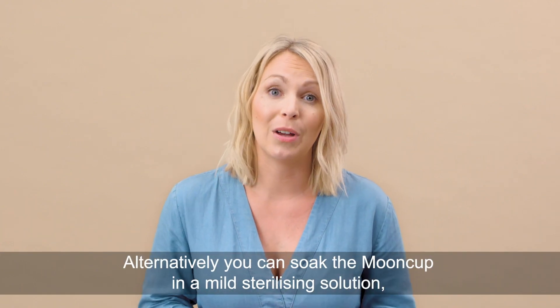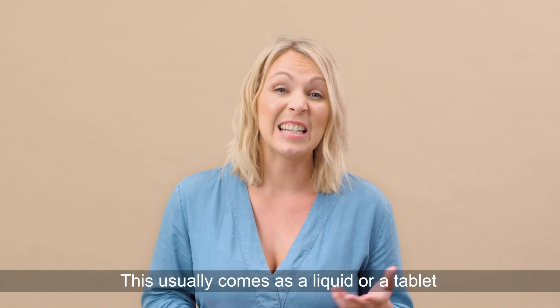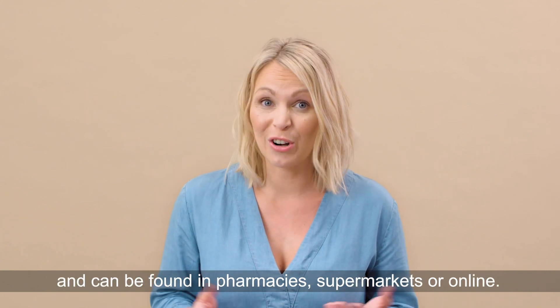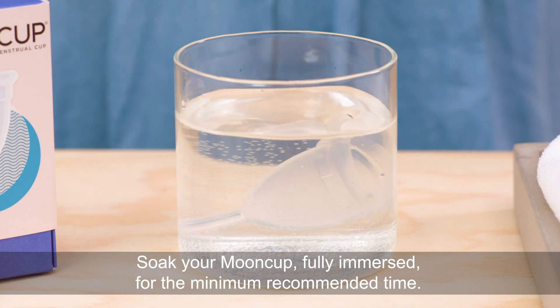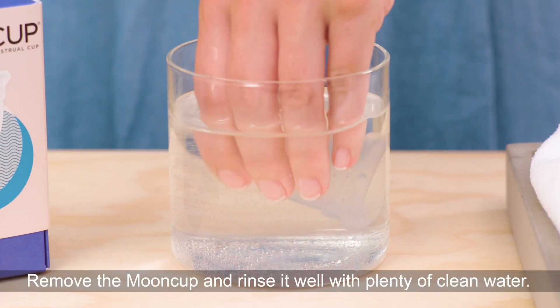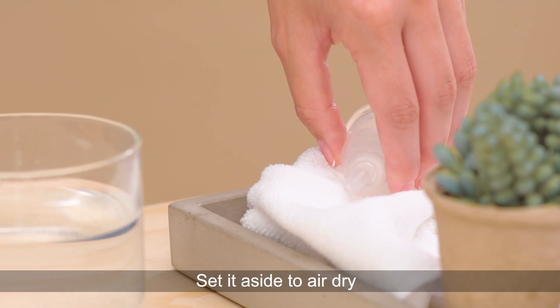Alternatively, you can soak your mooncup in mild sterilising solution, the kind used with baby equipment. This usually comes as a liquid or a tablet and can be found in pharmacies, supermarkets or online. Always follow the packet instructions for dilution. Soak your mooncup fully immersed for the minimum recommended time — usually around 15 minutes, but check the instructions. Remove the mooncup and rinse it well with plenty of clean water, then set it aside to air dry.